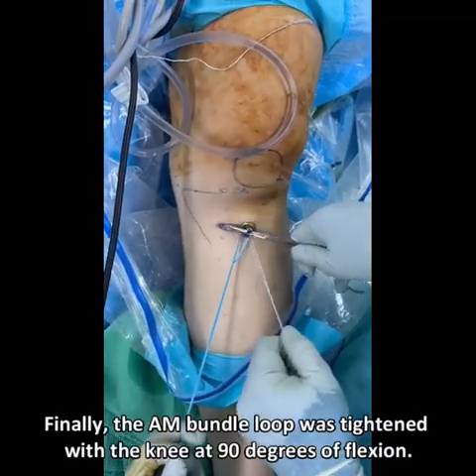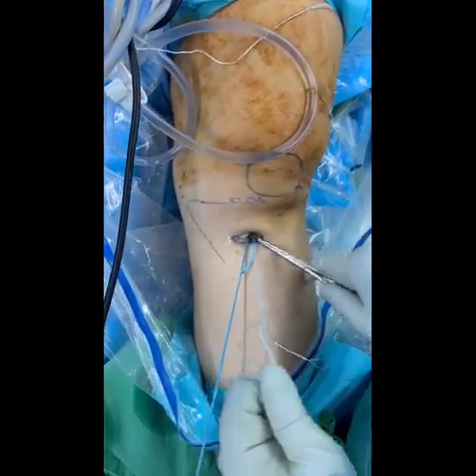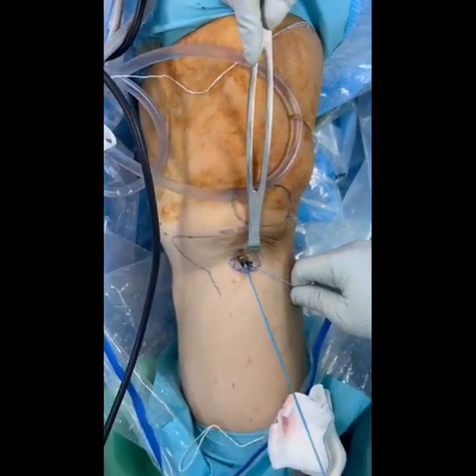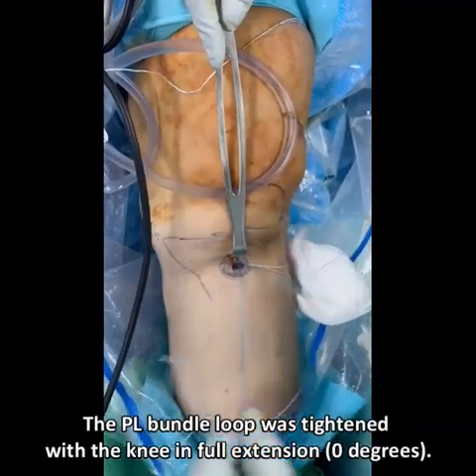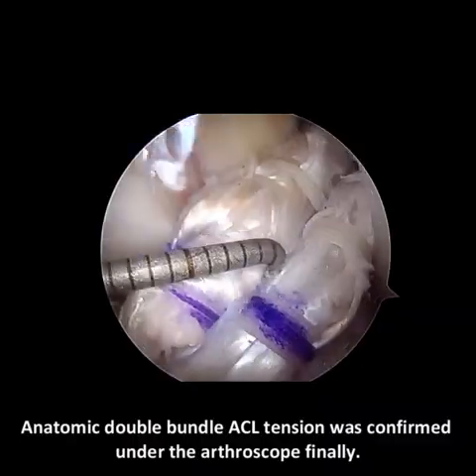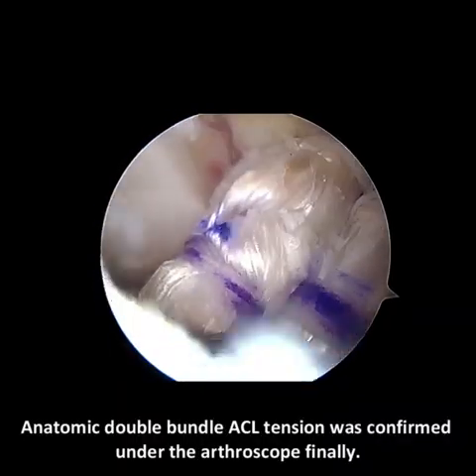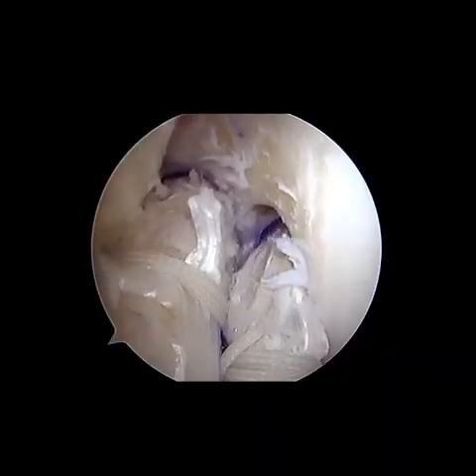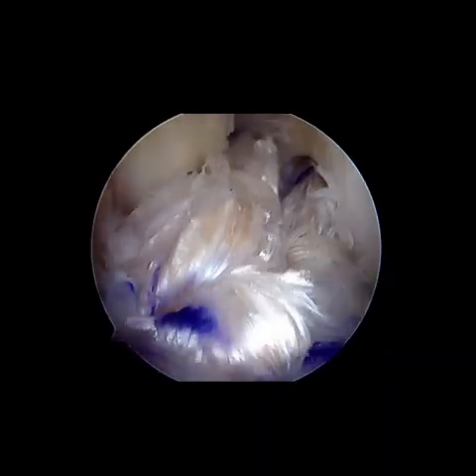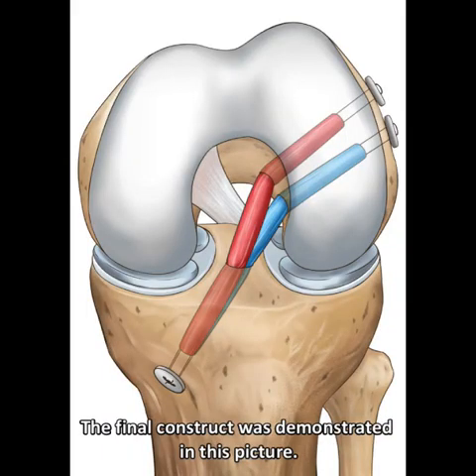Finally, the AM bundle loop was tightened with the knee at 90 degrees of flexion. The PL bundle loop was tightened with the knee in full extension. Anatomic double bundle ACL tension was confirmed under the arthroscope. The two four-folded AM and PL bundles were complete, and the final construct was demonstrated.